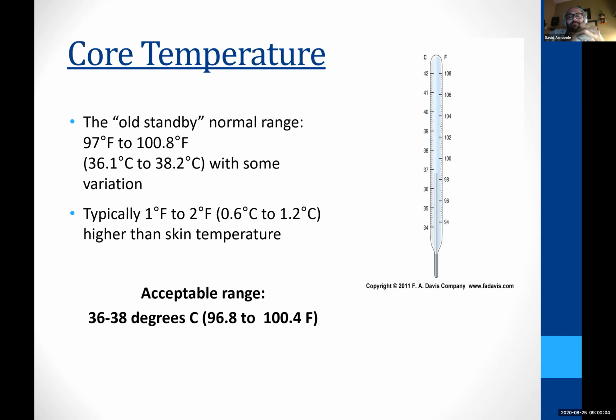When you do these temperatures, especially if you're doing oral, be sure they haven't had a cup of coffee or a glass of ice water right before you do it. It is going to change that. Wait about 20 to 30 minutes if you can before you take that temperature. If you say, oh man, your temperature is 101, and they say, oh, I just had coffee, okay, let's recheck that in 20 minutes before I start thinking you have an infection. Let's think about what caused that. Or if they haven't had anything, then I'm worried about it.